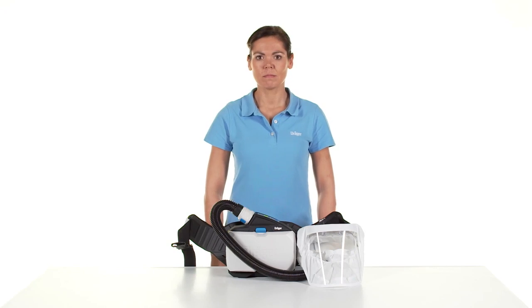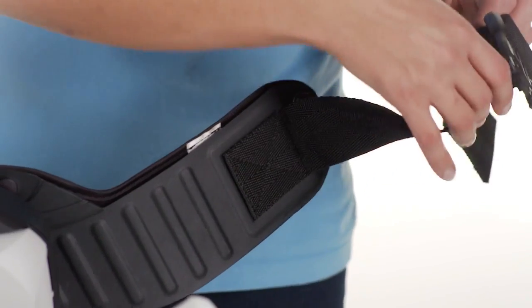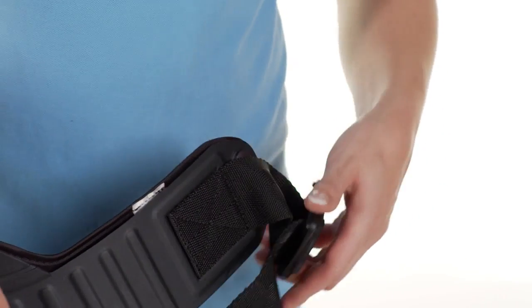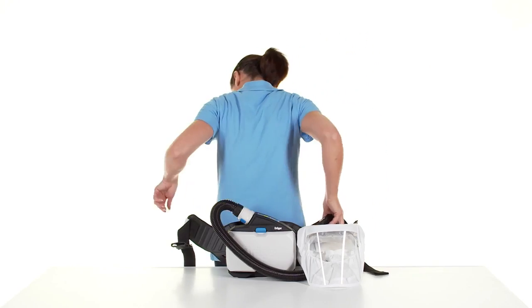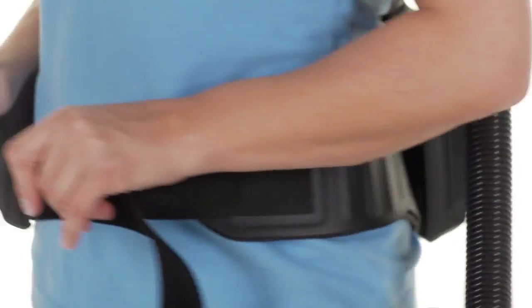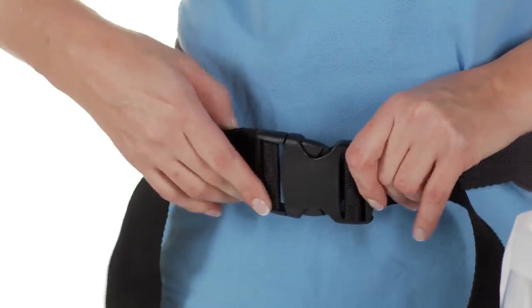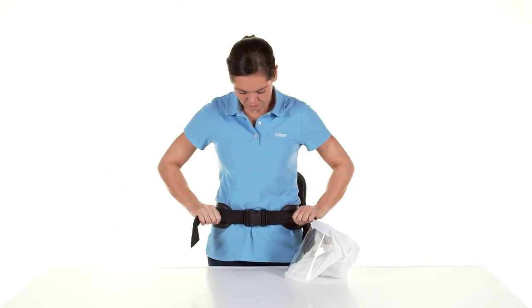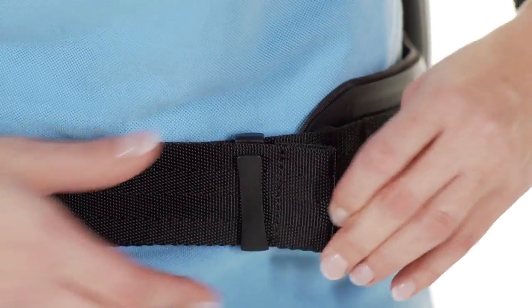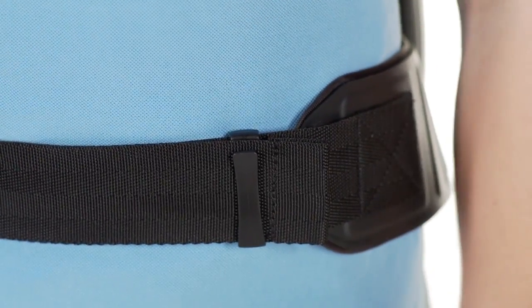To wear the device, adjust the carrying system to the approximately required circumference. Then put on the carrying system and close the buckle — the device is located on the back of the user. Tighten the strap. If necessary, it is possible to use strap clips to fix protruding ends.